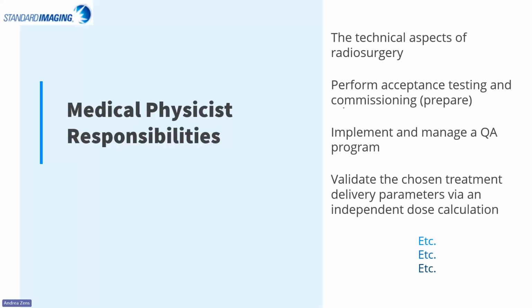And since I'm likely mostly speaking to qualified medical physicists here, it absolutely goes without saying that you play a vital role in many of these resource recommendations. MPPG 9A goes on to specifically outline 10 key responsibilities of qualified medical physicists. I've only listed a few of these here since this will be the focus during the rest of the webinar.